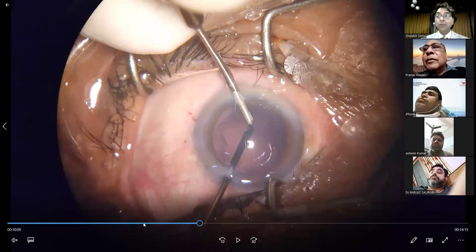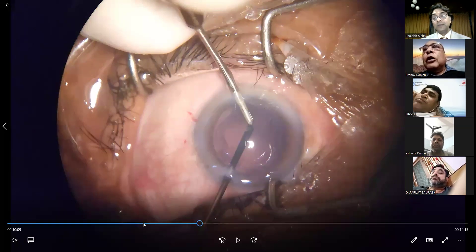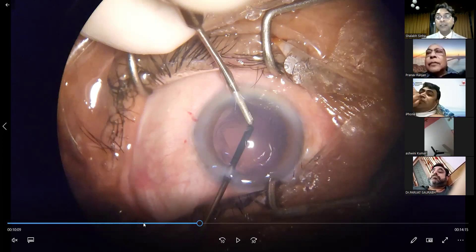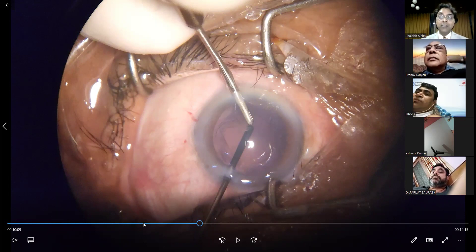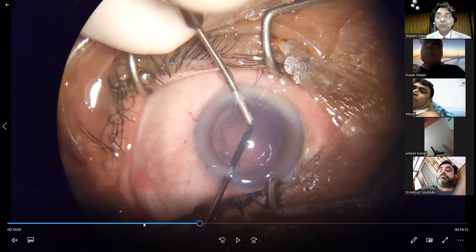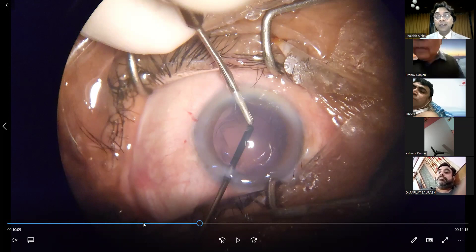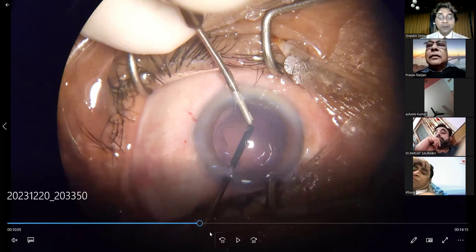I am using an Omni-glow here, which gives a very good red reflex. Even without an Omni-glow, with normal illumination, if you tilt the eye you can see. My guess is that the PCR had occurred but the flow of fluid caused it to open up and allowed the anterior hyaloid to come forward. That is what I believe happened.